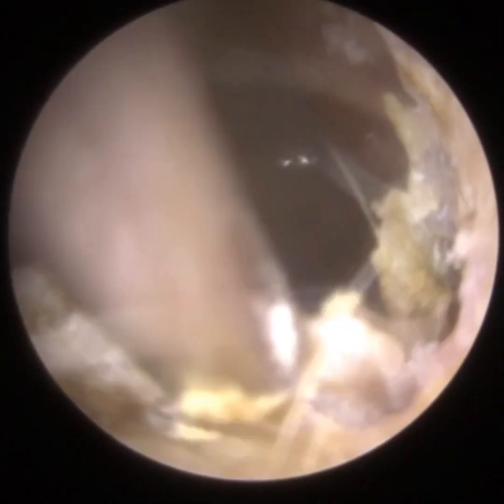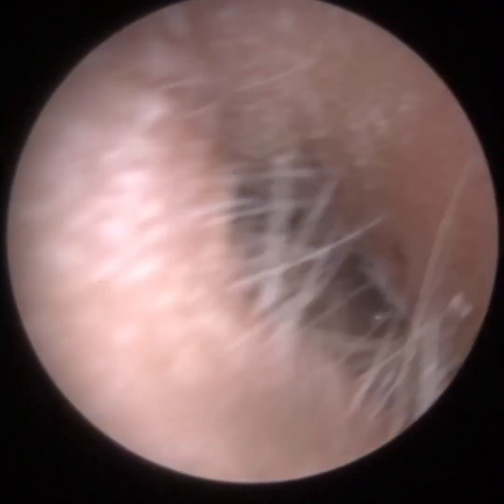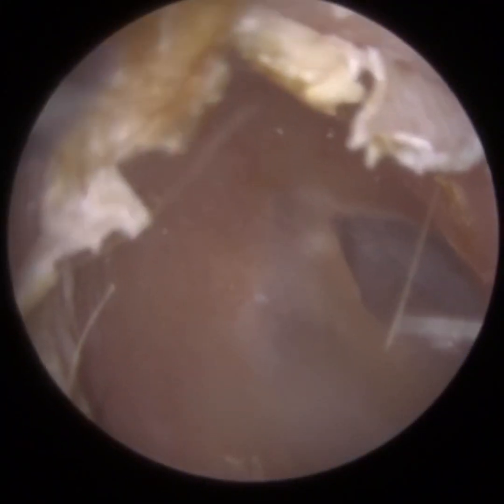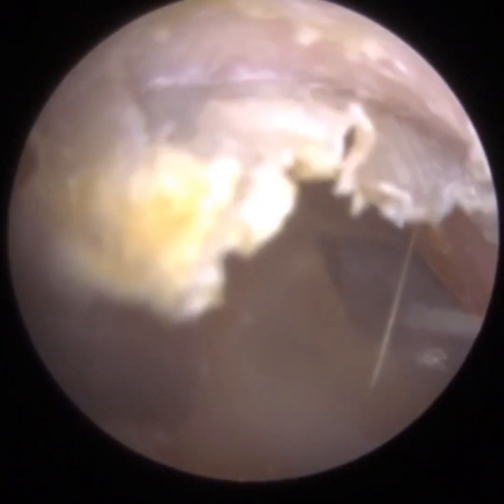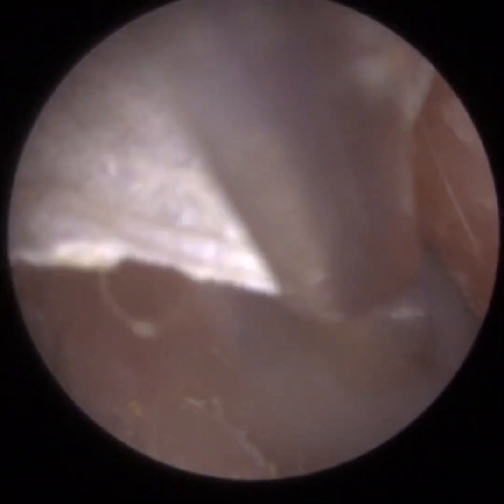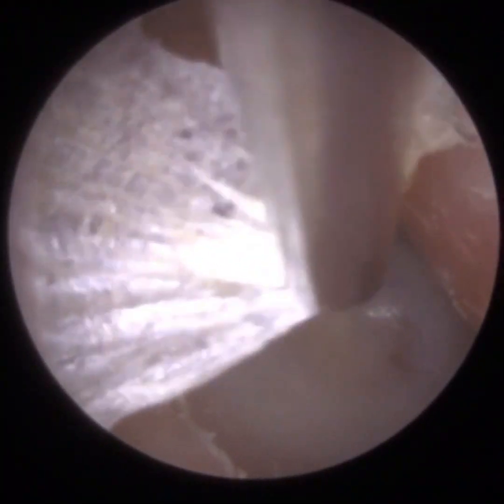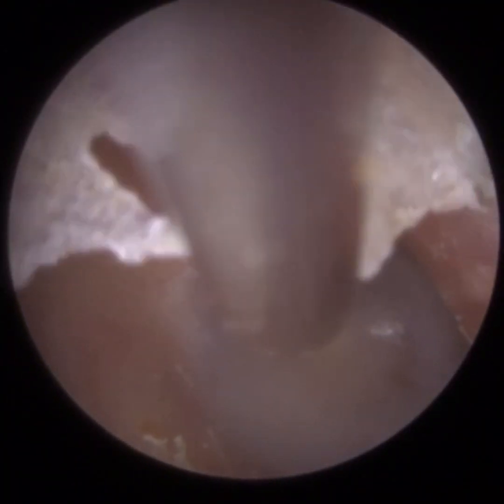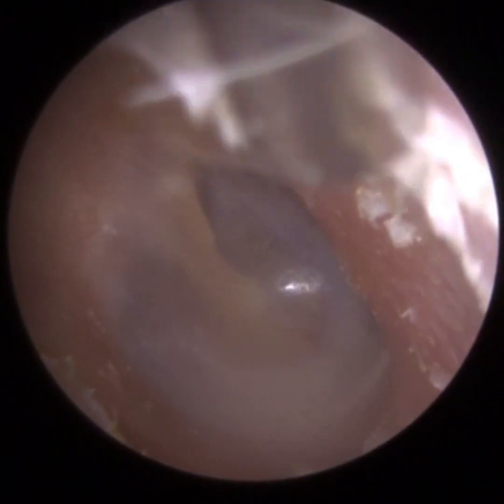So just gently lifting it off the base of the ear canal here — we're quite lateral near the entrance. The skin adhesions here are quite strong. I always compare dead skin keratin to double-sided sticky tape. Typically you have one side that sticks itself onto the surface of the ear canal, and the underneath side quite often envelops itself around the plug of wax. When we're peeling the skin, imagine you've got a postage stamp on a letter and you gently peel that off without tearing the envelope itself. That's what we're doing when we peel the dead skin off the ears — it's a very delicate procedure that requires a lot of finesse and obviously a steady hand.